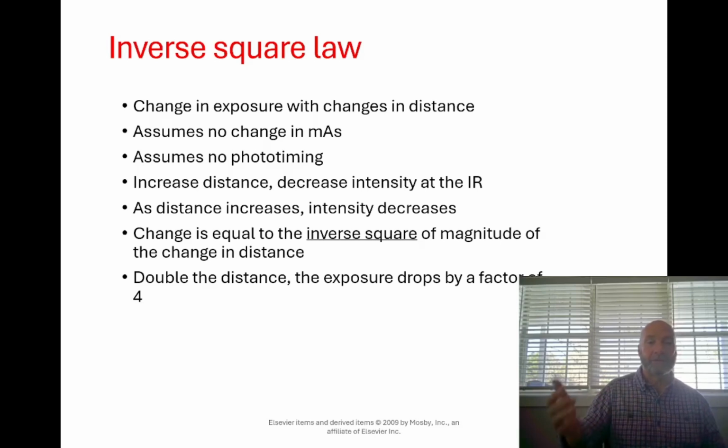Okay, so this is the inverse square law. Inverse means as one thing goes up, another thing goes down. So it's kind of like reciprocity. If you increase mA to maintain the same mAs, you've got to decrease time. Only it's a little bit different. In this case, with an increase in distance, your intensity is going to decrease.